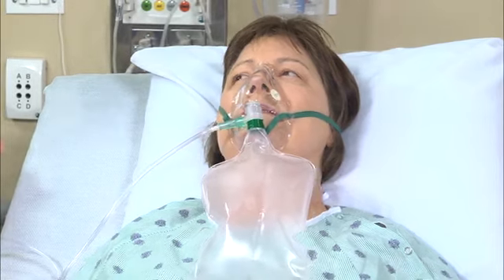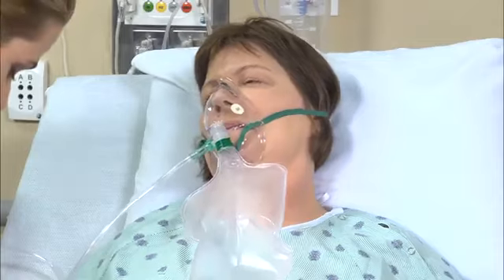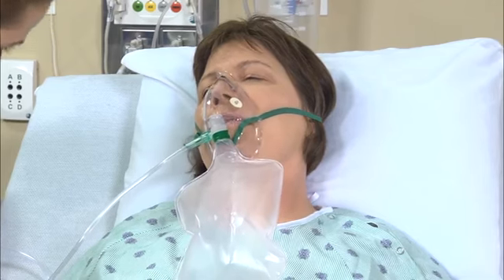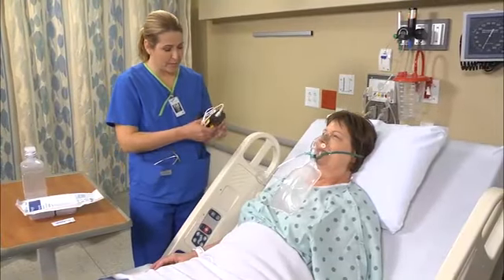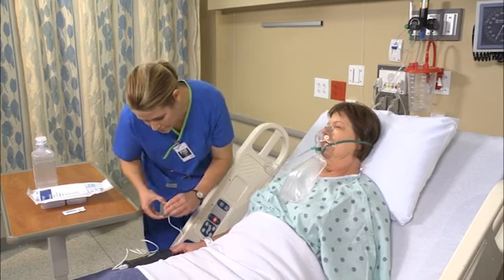Good morning, my name is Erin. I'll be your nurse for today. Then identify her using 2 identifiers. Can you verify your full name and date of birth? I'm Cheryl Kennedy, April 3rd, 1957. Thank you. Place a pulse oximeter on the patient's finger and leave the device in place.